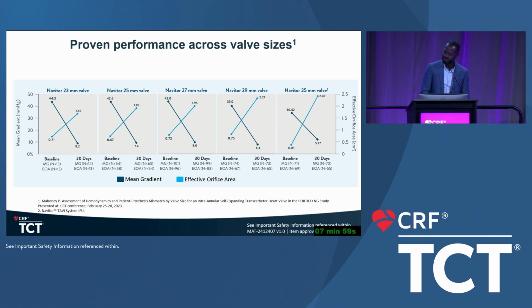Yeah, I think less and less I think about valve choice as regards to pacemaker, because thanks to innovations in these valves, we've gotten better at implanting them, right? Because we have some control over pacemakers, and that's really implantation height. That's what we control, all right? And so because the valve platforms have become more reliable and more predictable, I use that less as a decision maker in my practice.